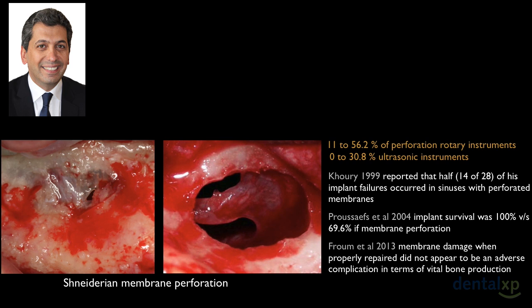This perforation can occur during bone preparation or during membrane elevation. It is different if we use rotary instruments or piezoelectric instruments. The risk is significantly higher when we use rotary instruments. If we combine the studies, we had between 11 and 56% of reported perforations with rotary instruments, and from 0 to 30% of perforations when using ultrasonic instruments.